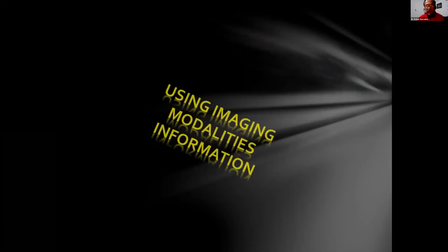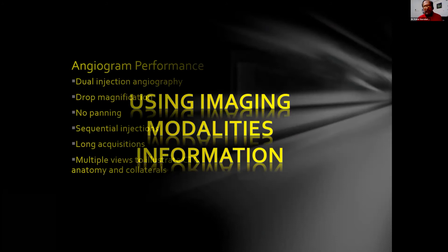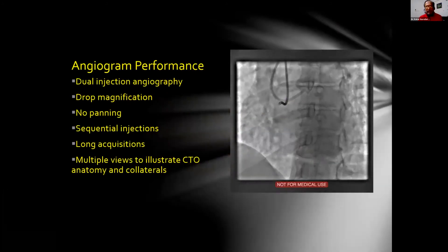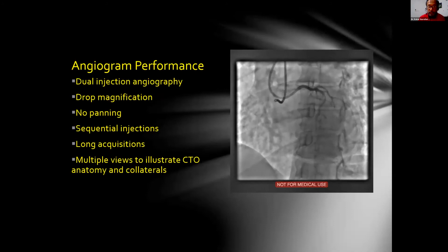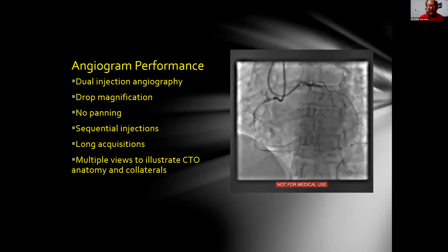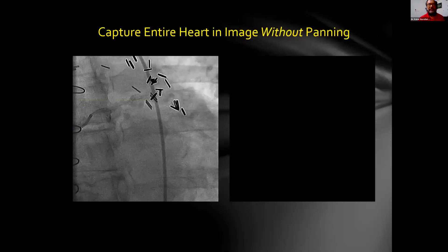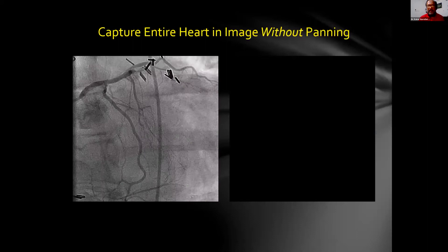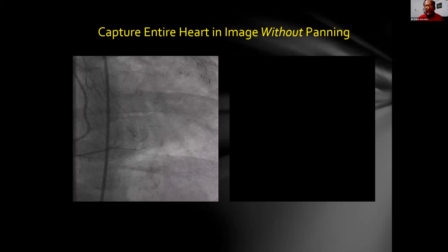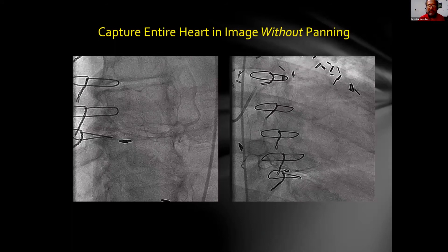First, using imaging modalities for information. You have to do the angiogram properly: dual injection, drop magnification, no panning, sequential injection, and long acquisition so you can see the CTO very clearly. This is a faulty angiogram, and this is the correct angiogram where you don't pan the table — you can see the CTO very well and the collaterals as well.